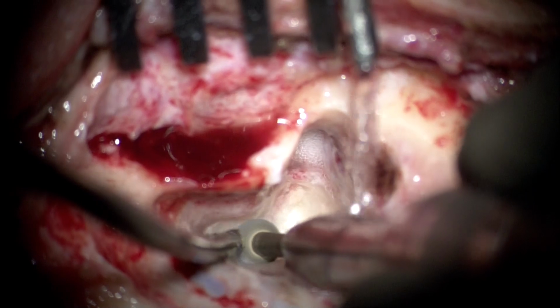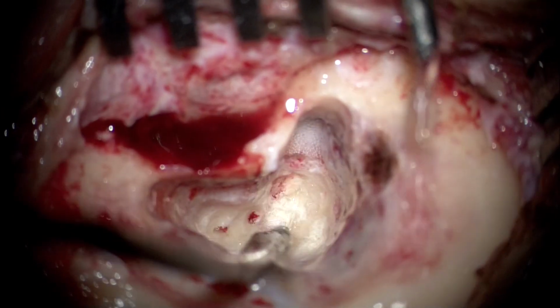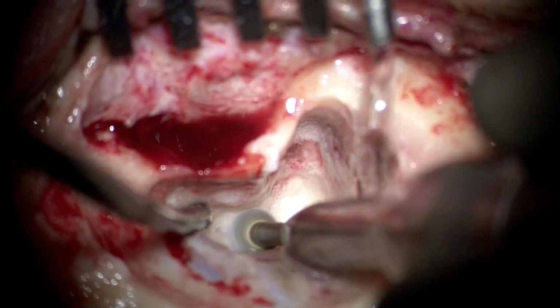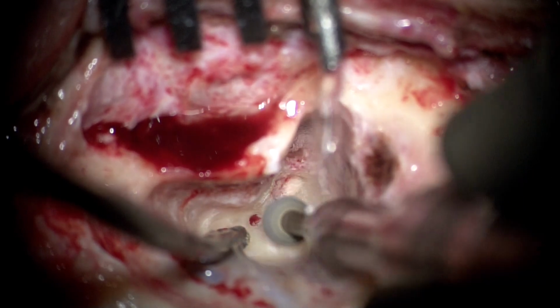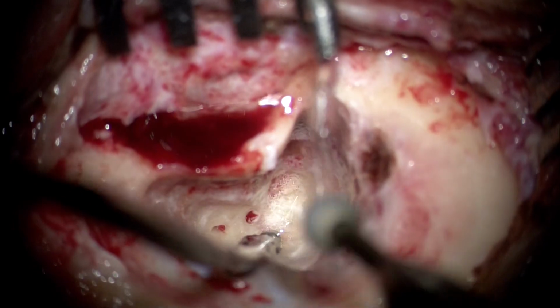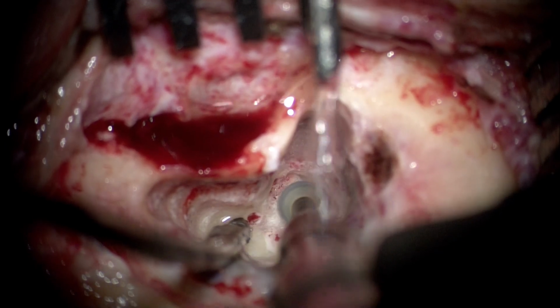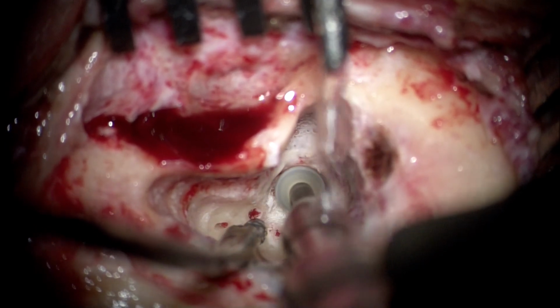As seen here, the vestibule has just started to open, as all three canals have been nearly drilled. We can see how every fraction of a millimeter of space that we have managed to expose is now being drilled completely, emphasizing the importance of a very reasonable and generous lateral exposure before we commence this kind of medial drilling of the labyrinth.